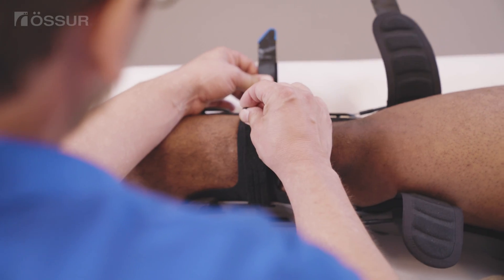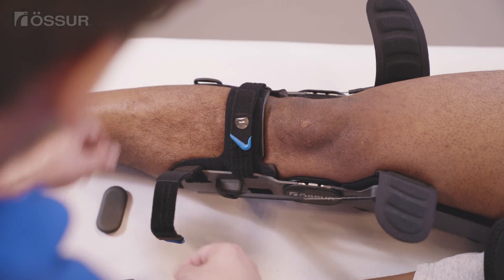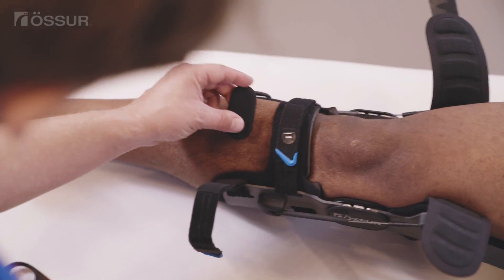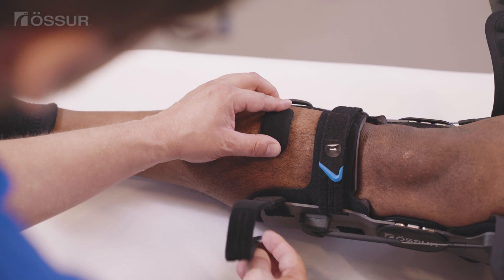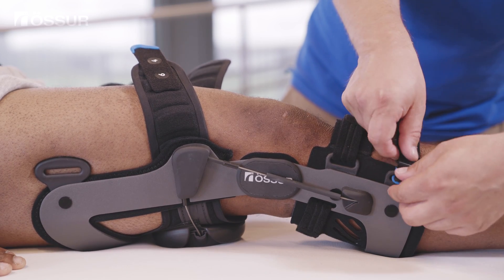Fasten the proximal anterior shin strap. Adjust or trim the strap length if needed. Position the shin pad and fasten the distal anterior shin strap by inserting it through the D-ring.